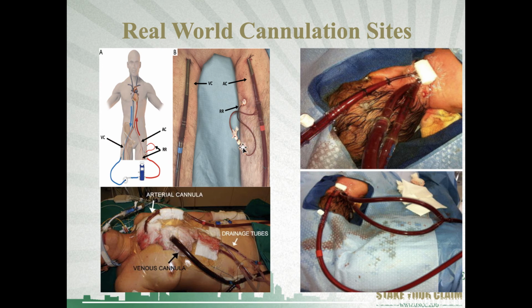Sometimes we have to monitor for this and check Doppler pulses in the feet and see if we're perfusing the feet. Oftentimes you'll see it turn blue. This cannula is providing antegrade flow to the distal areas of the leg to provide that oxygenation in lieu of this cannula. Right here you have your baby.